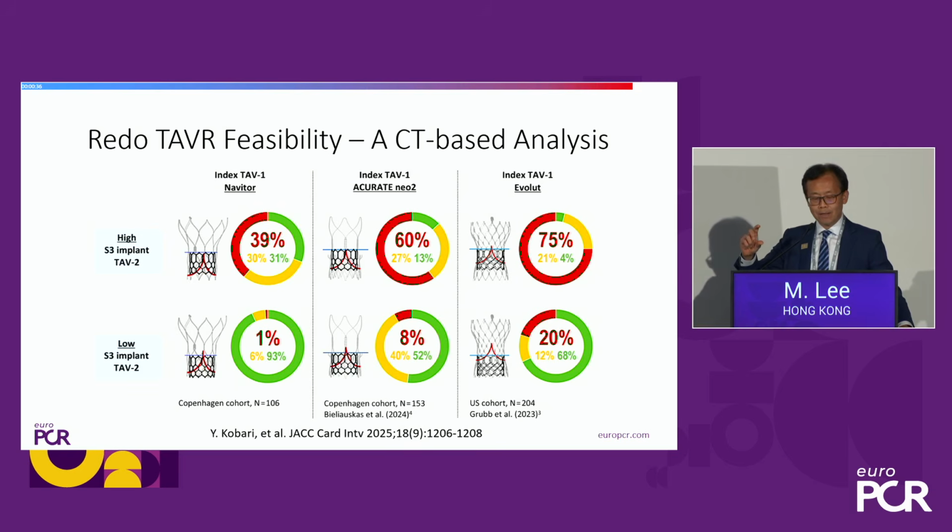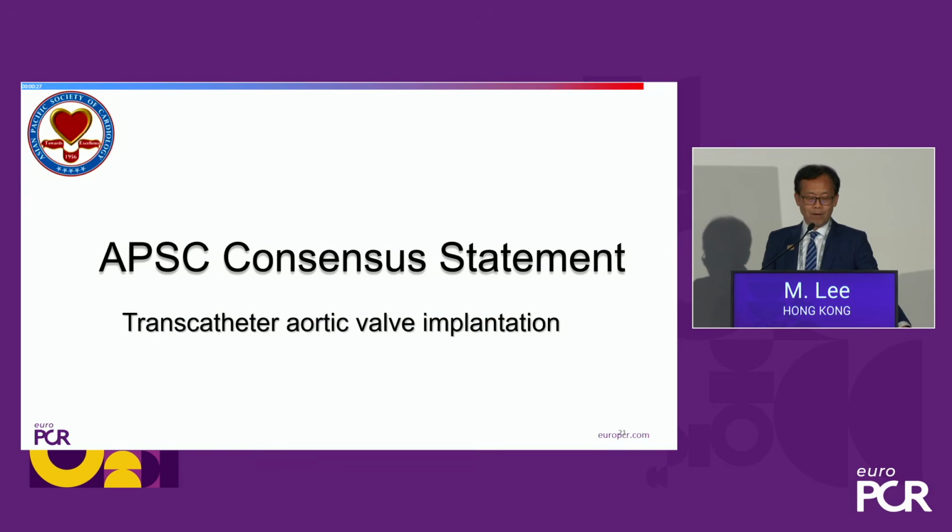suggested optimal height. It would actually give a better result as compared with the other self-expanding valves if we put in a second valve with this balloon expandable device.